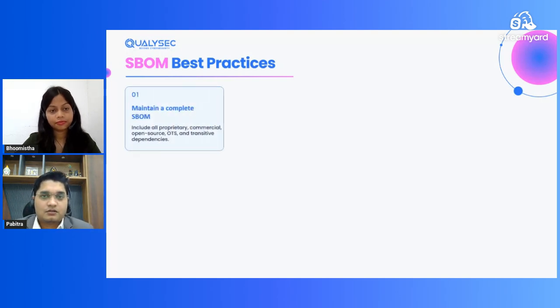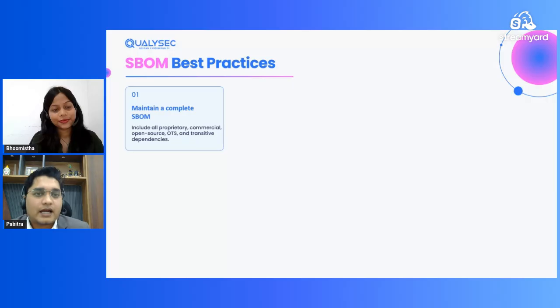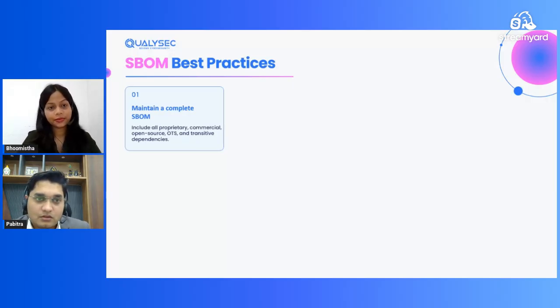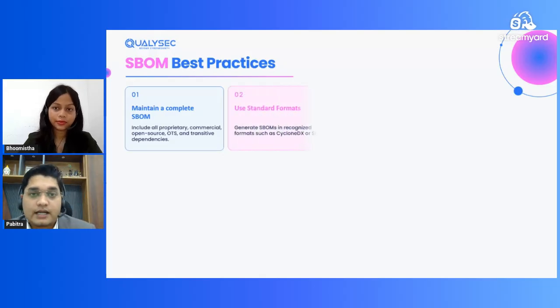Starting with maintaining a complete SBOM report. Never ever send 3-4 pages of an SBOM report. List out each and every component that you are using, whether it is commercial, proprietary, open source, or any third-party component. You have to list out everything and provide it. Second, use a standard format: generate the SBOM report using CycloneDX or SPDX. You can use any of them to prepare the format.